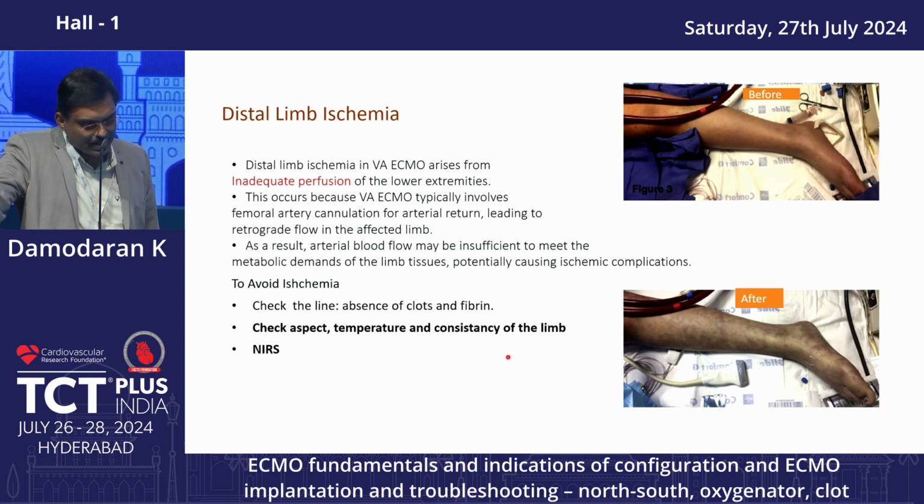NIRS is the one which we are not having. NIRS, that is also easy. The other thing, previously when we were discussing, I was about to ask you, when you are putting a large cannula retrograde and a distal perfusion cannula, we always have the habit in our practice of decannulating surgically, because in between there is a dead space.